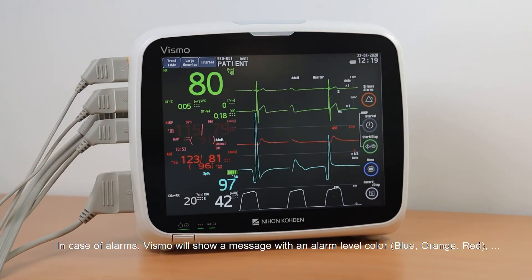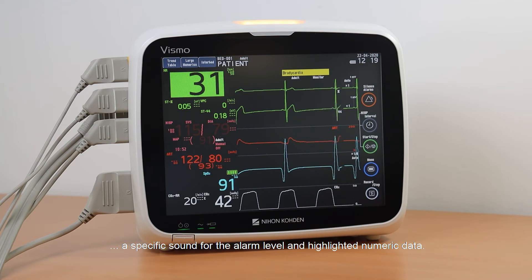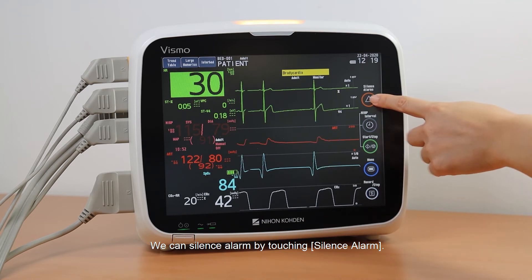In case of alarms, Vismo will show a message with an alarm level color — blue, orange, and red — a specific sound for the alarm level, and highlighted numeric data. We can silence the alarm by touching Silence Alarm.